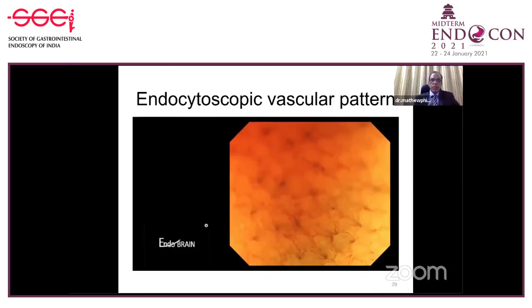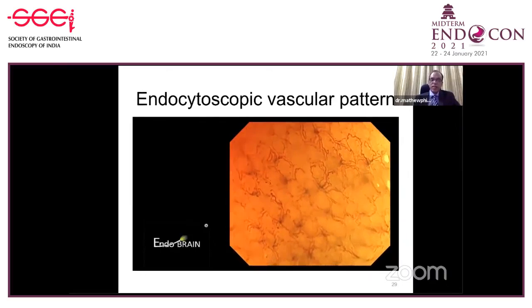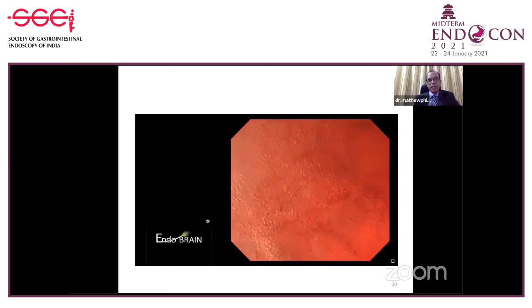This is one of my patients, just to show you the colonic. Just click it, or press for next slide. It's a video. You can see the blood vessels around the crypts, and you can even see the RBCs going through that. Next slide. And here, without any staining, you can see the crypt lumen, and also you can see the blood vessels there. Next slide.